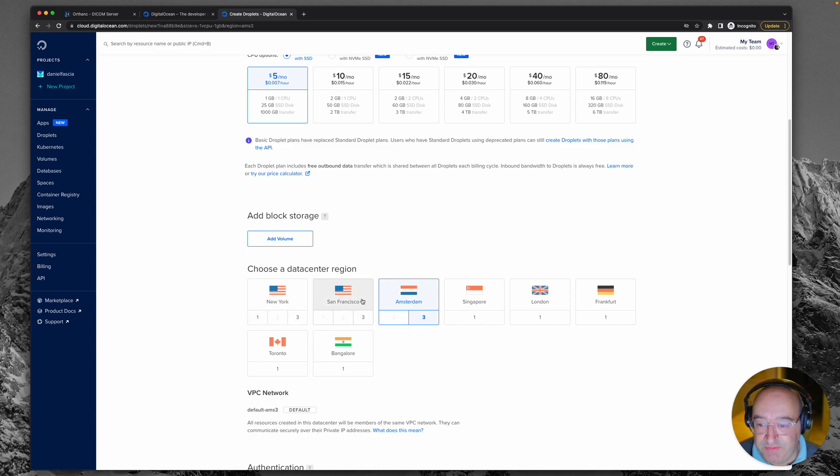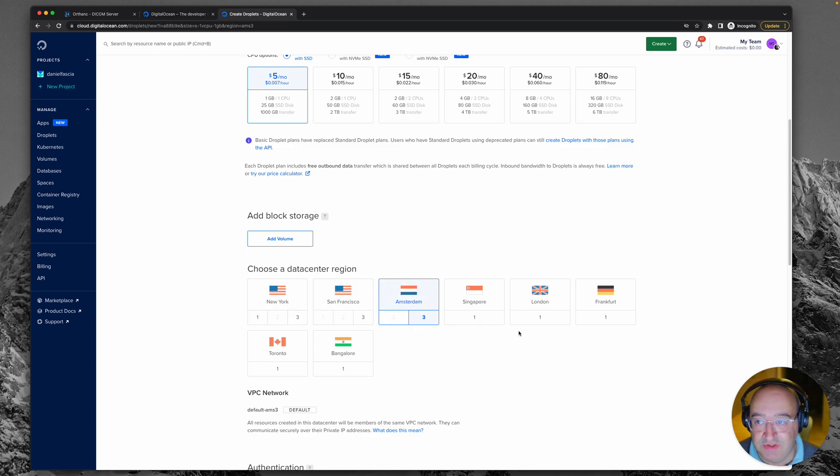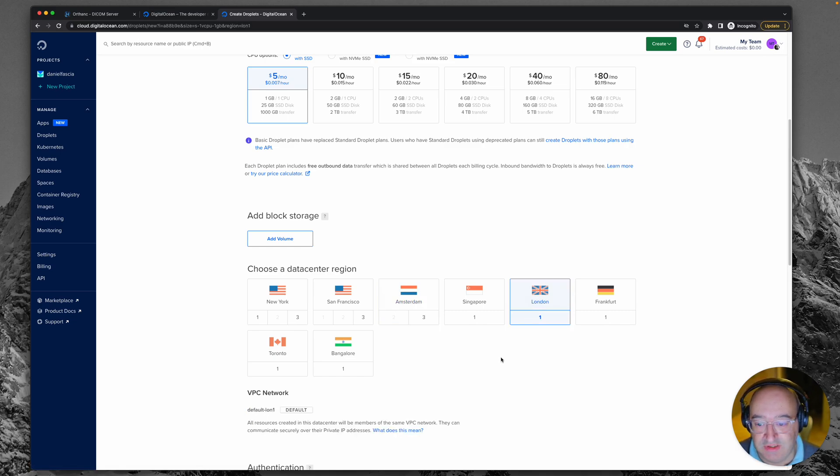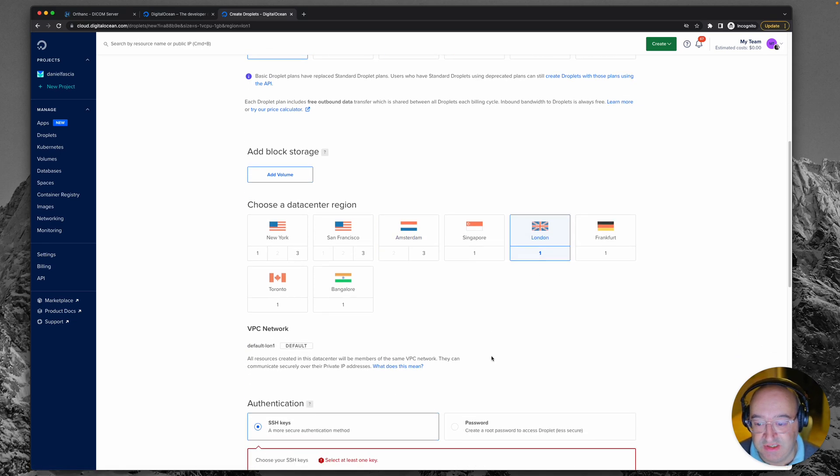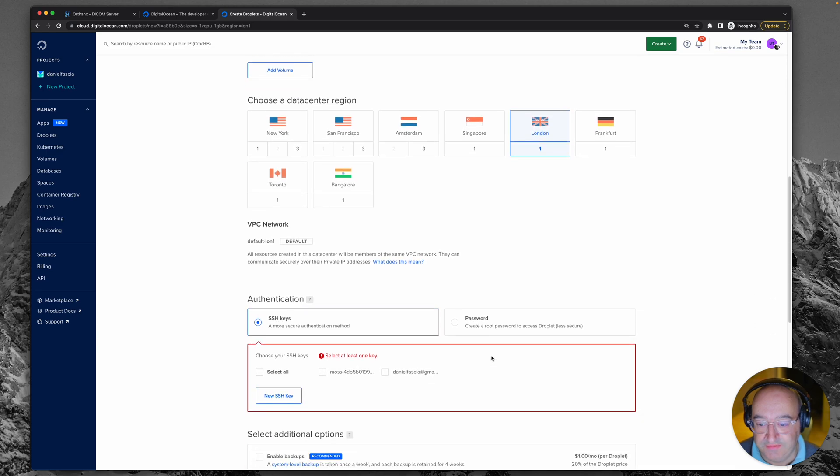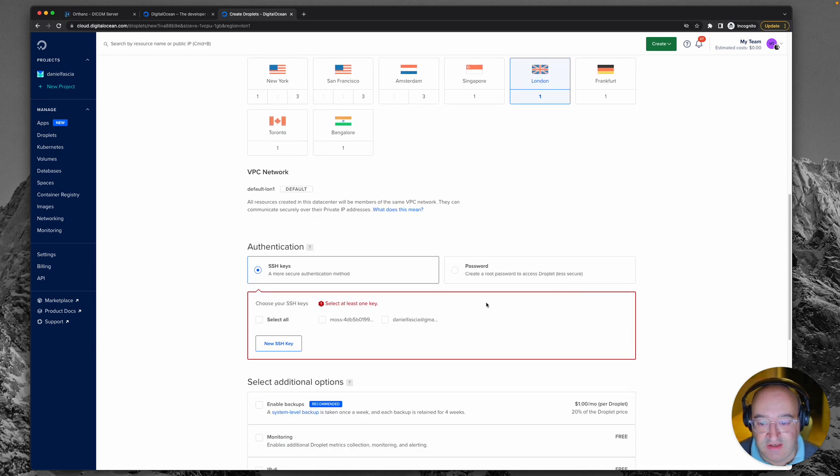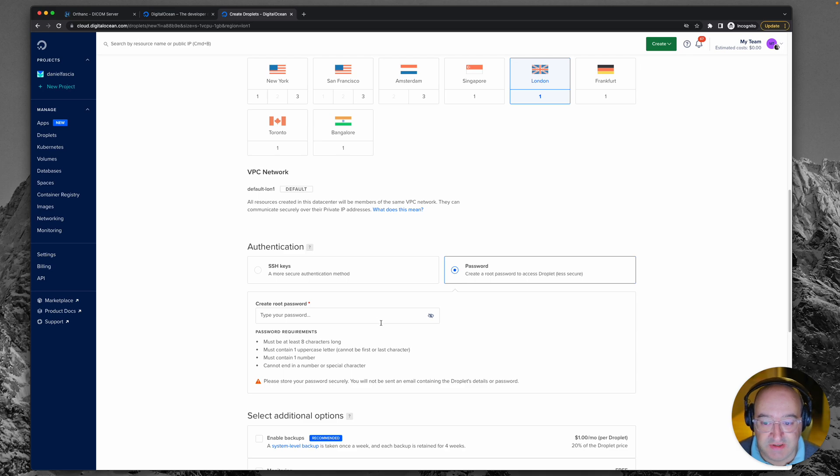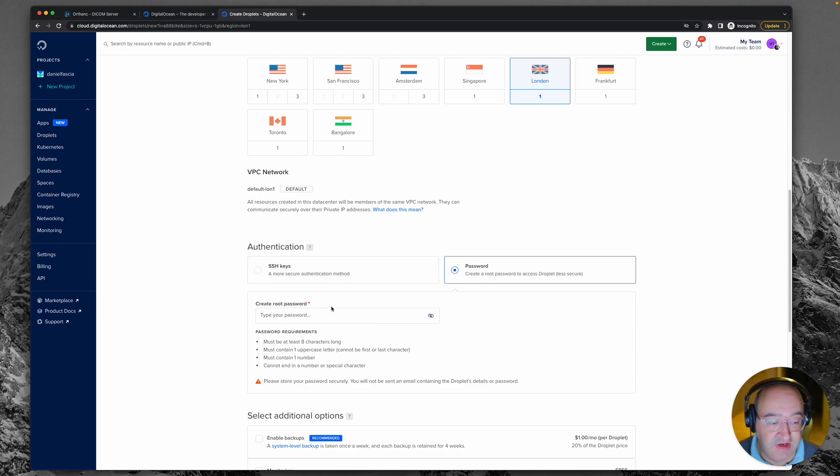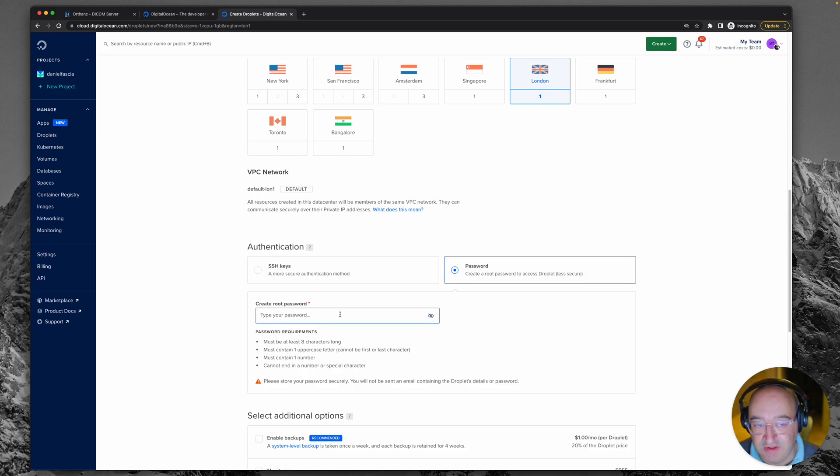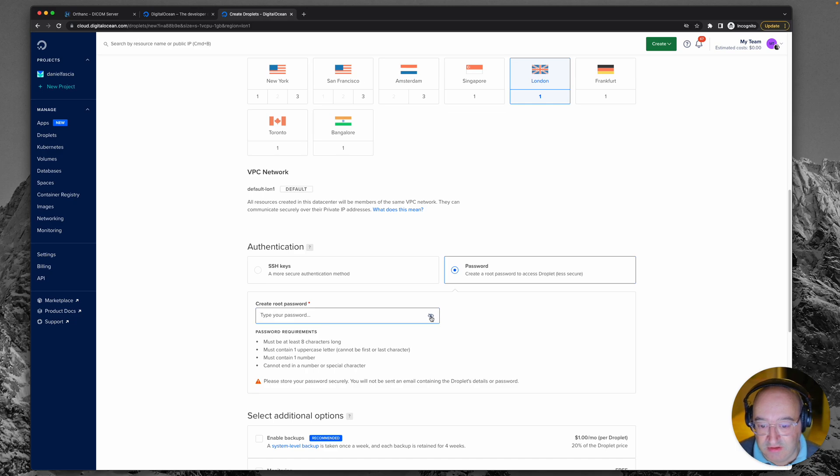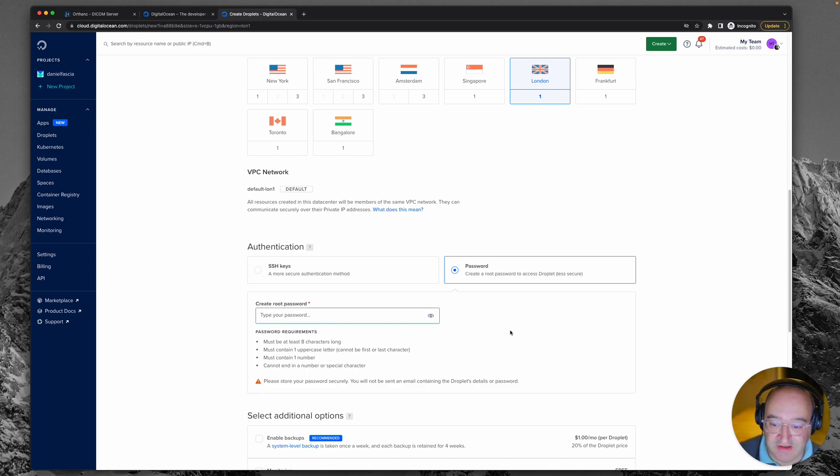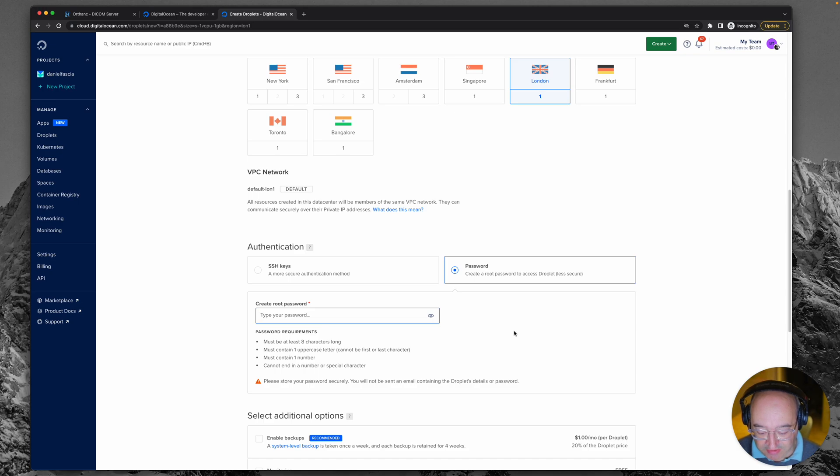When you pick your data center region, generally you want to go for something which is close to you, so I'm going to go for this one in London because I'm in the UK. I'm going to choose a root password although it is much better practice to use SSH keys. If you don't know what they are then just stick with the password and pick a nice secure one. I will not pick one that's that secure for the purposes of this tutorial but something I can remember easily.